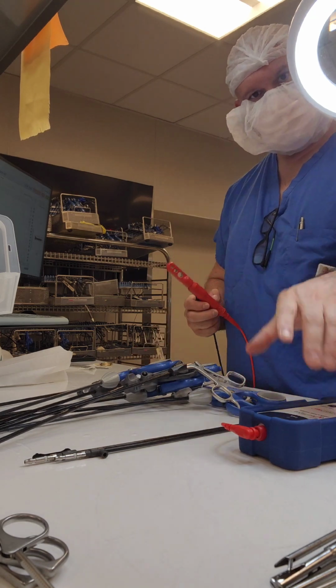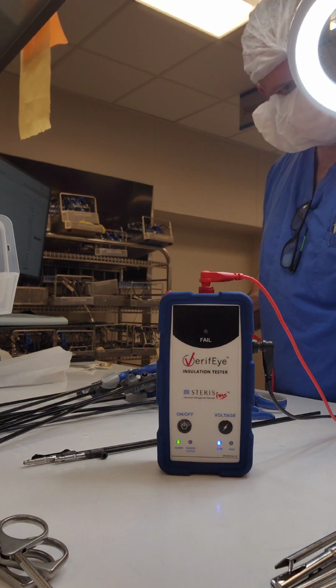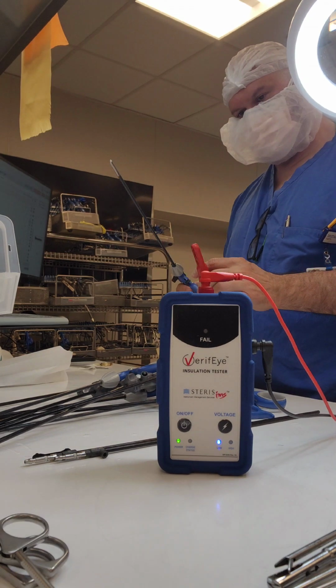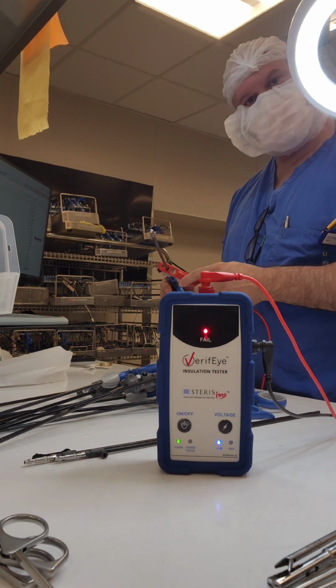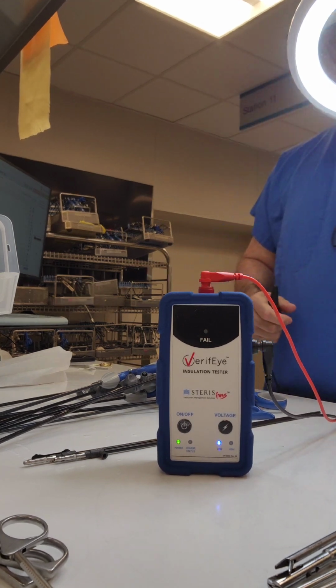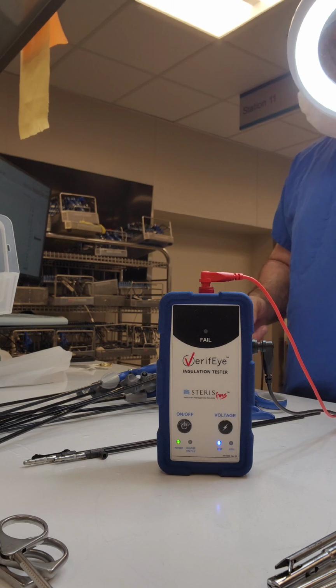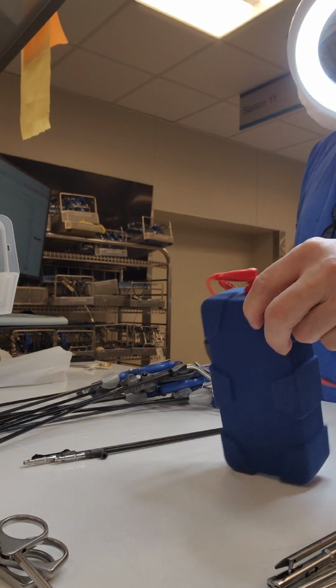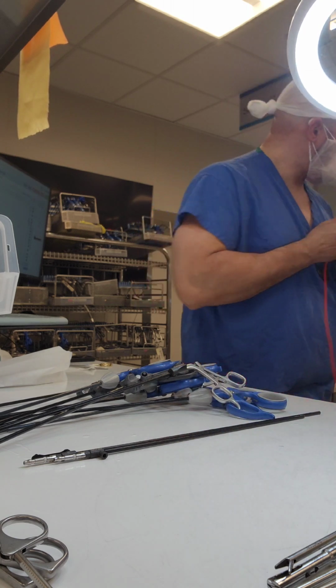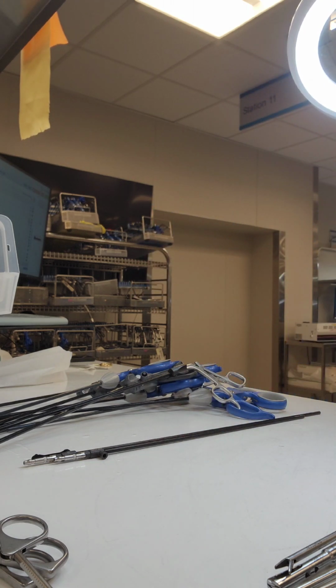All right, I want to show you that one instrument that failed. So I'm hooking this back up, grabbing my little tester. See the red dot on the top right there, right at the base? That little red fail right there. That's a bad instrument. It's definitely going to beep in the beginning because there's metal, and then along the insulation, it should not beep, and not at the base either.